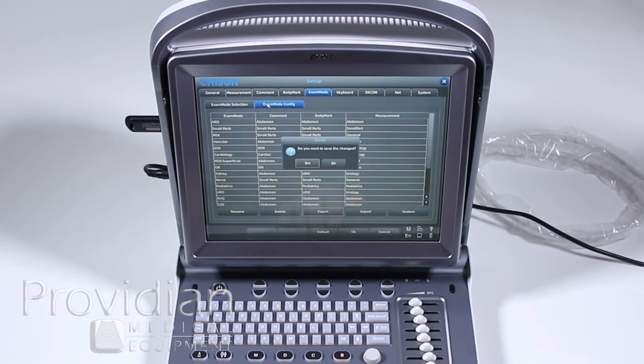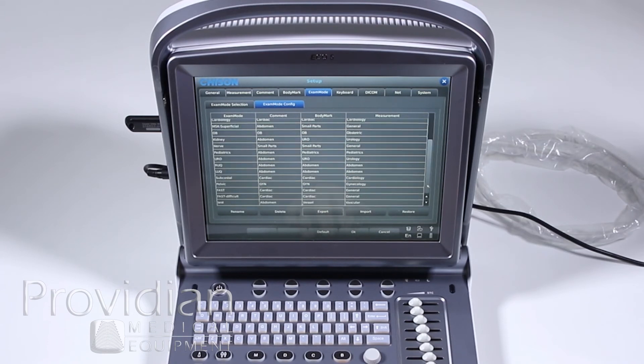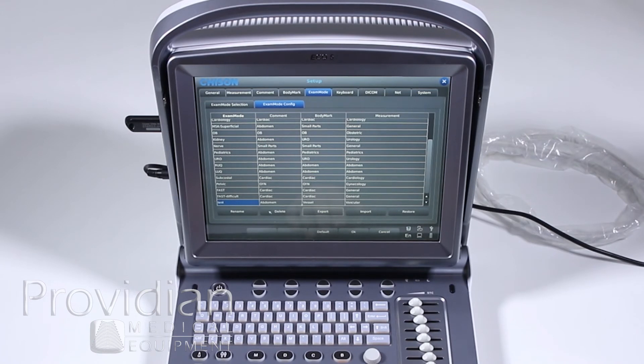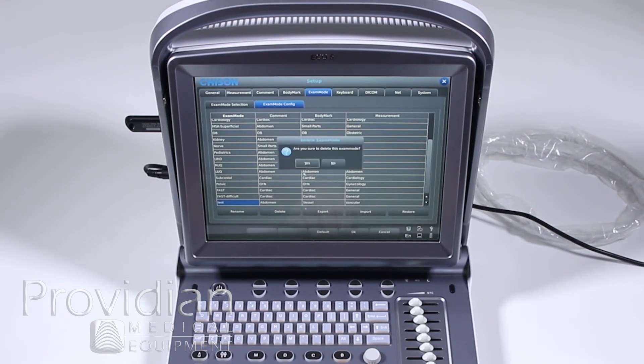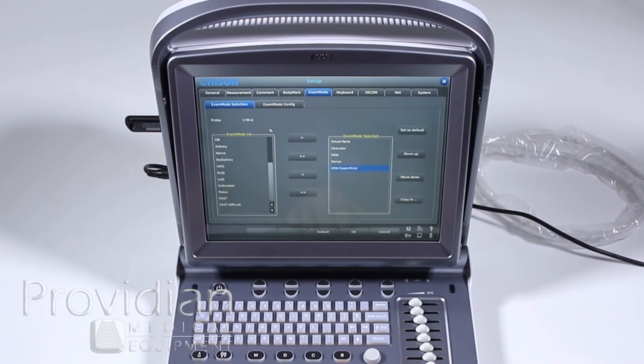And then, exam mode configuration. And we had that one that I created that I don't want at all. I had this test one that is not useful. I'm going to go ahead and delete, and I'm going to delete that exam mode. So no longer will it be in this exam mode selection.